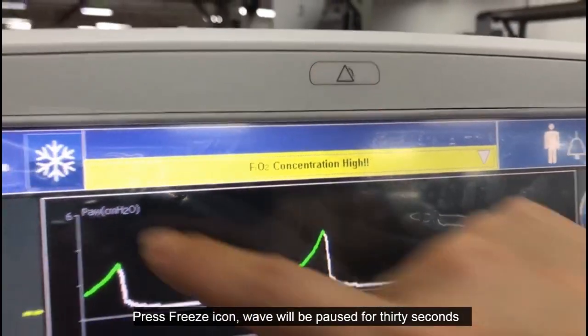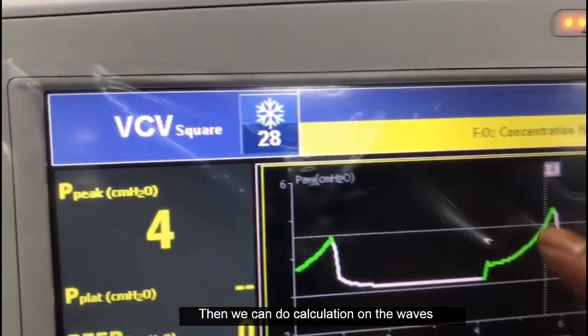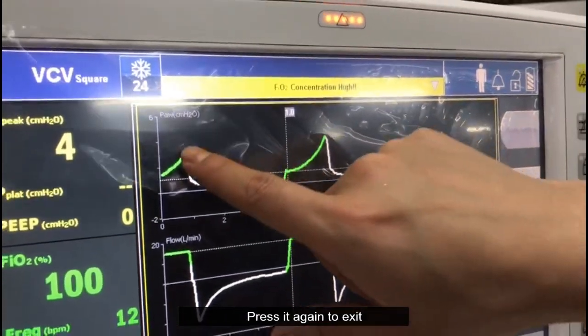Press the FREEZE icon and the waveform will be paused for 30 seconds, allowing you to perform calculations on the waves. Press it again to exit.